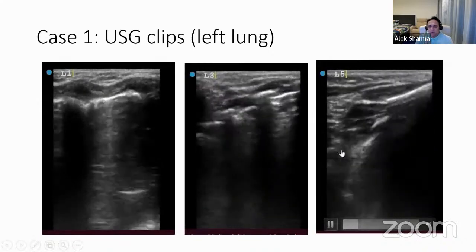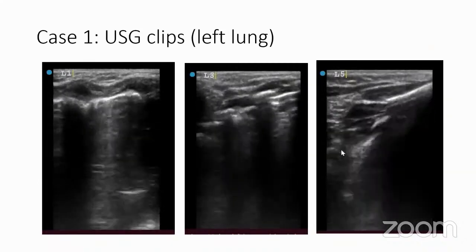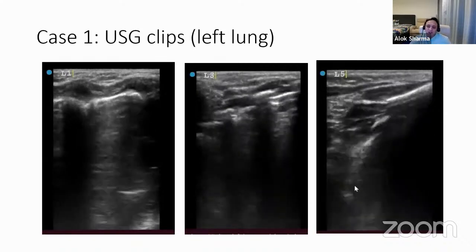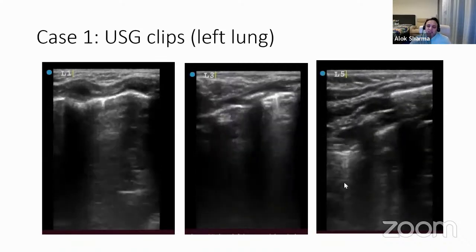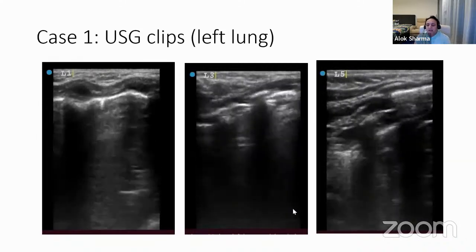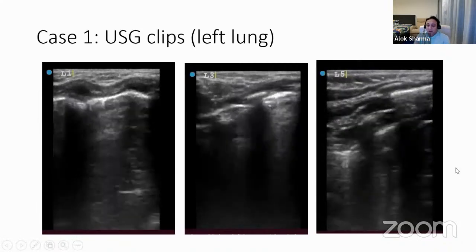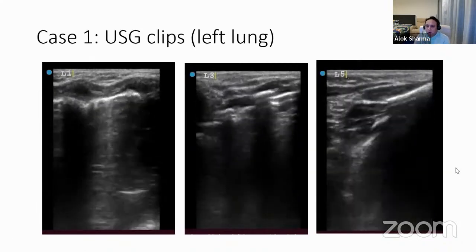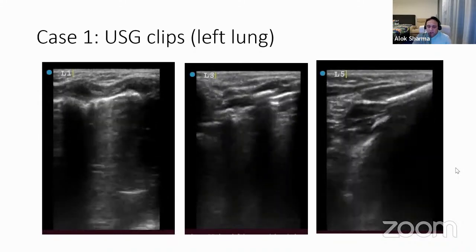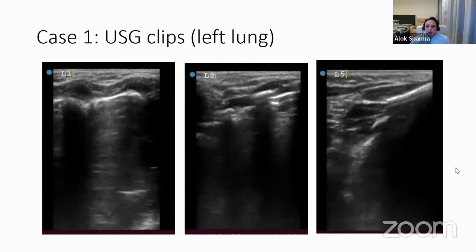Now, if your baby's moving, the question is, are you applying too much pressure? I suspect that to try and better your image, you're applying a lot of pressure, which is why the baby is recessing more. When you put the probe on, the weight of the probe should be completely off the baby. It's mere contact that you want. The more you struggle with image resolution, the harder you press, the more difficult it'll be to get images.